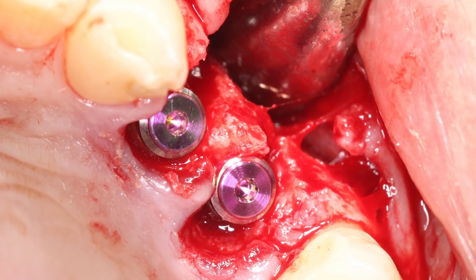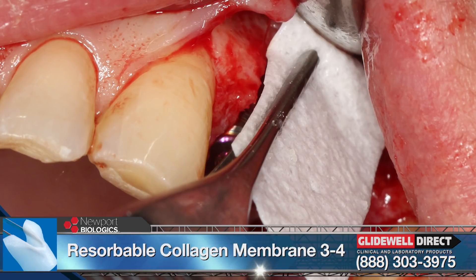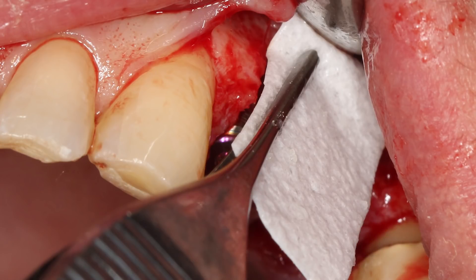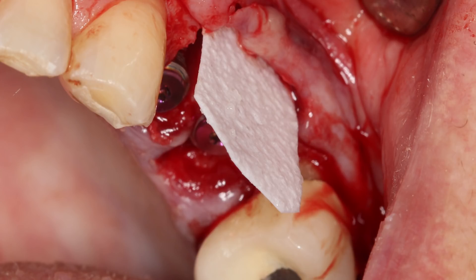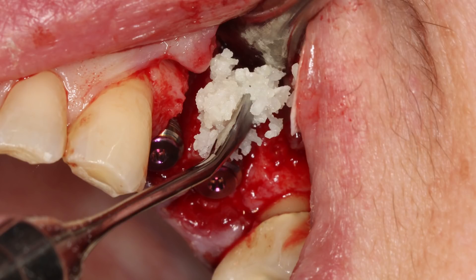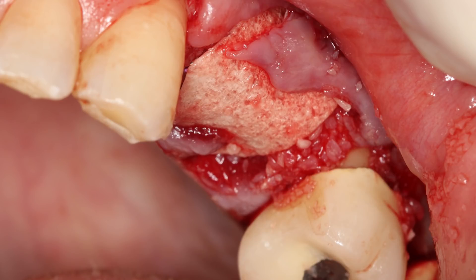Cover screws were hand tightened into place, which allowed for the folding of the resorbable membrane over the crest of the ridge to protect the graft material on the facial aspect of the implant site. A significant gap between the stable implants and the bony walls of the alveolus was noted. For proper control when placing the bone graft particles, the membrane was passively positioned 2 millimeters or more past the most apical portion of the facial defects. For this reason, it was imperative that the envelope flap extends significantly beyond the facial defect. The mineralized cortical cancellous allograft material, hydrated with sterile saline to create a paste-like mixture, was placed between the implants and the facially positioned membrane. The membrane was simply tucked over the surgical site to engage the palatal bone a minimum of 2 millimeters apically.